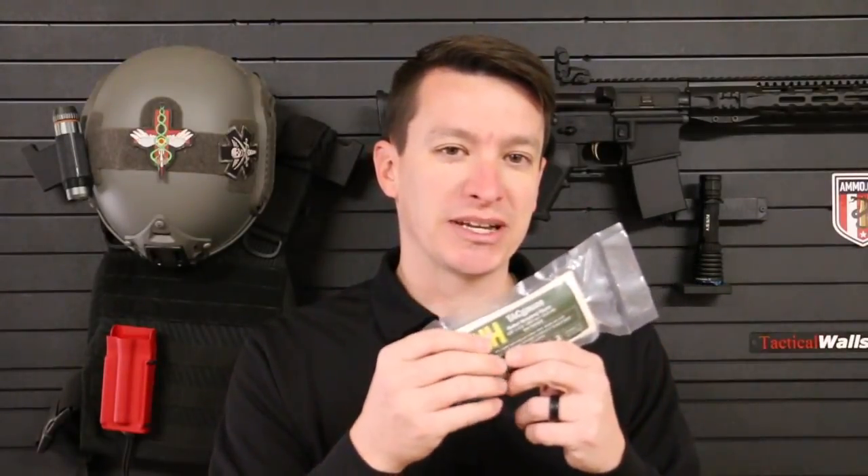A couple of things I think you guys will be excited about is this compressed gauze is made in the USA and it doesn't have an expiration date. I'm super excited because this is made in South Carolina, my home state.